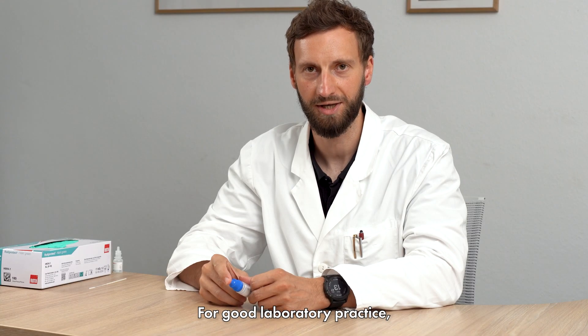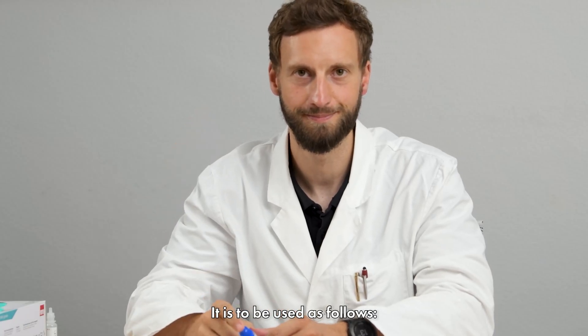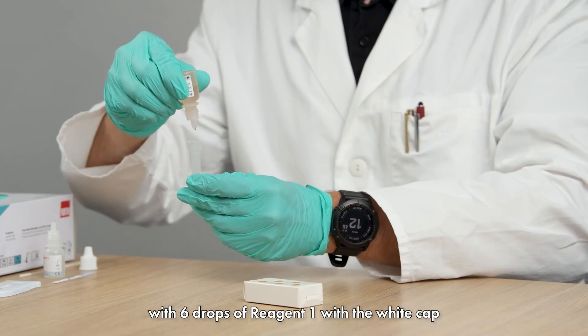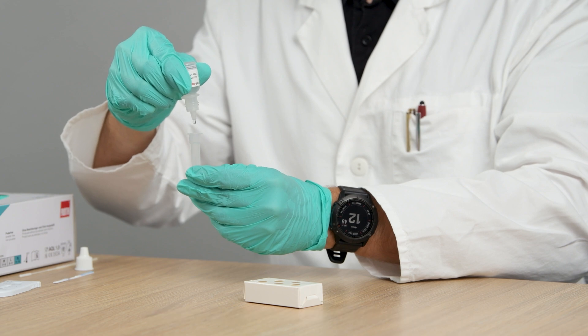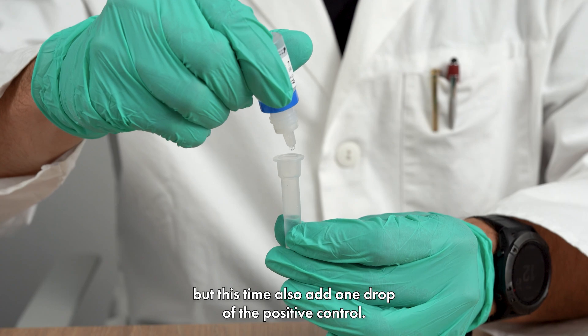For good laboratory practice, a positive control is also included with the test kit. It is to be used as follows. Mix the solutions again, as already demonstrated, with 6 drops of reagent 1 with the white cap, and 4 drops of reagent 2 with the red cap.